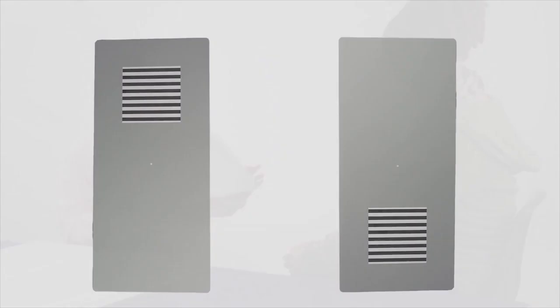The examiner is being shown holding the cards in a horizontal orientation, which is the standard and most common way of presenting Teller acuity cards. However, the cards may be held in a vertical orientation with the grating either on the upper or lower part of the card. This can be a useful method for testing patients with nystagmus or strabismus.